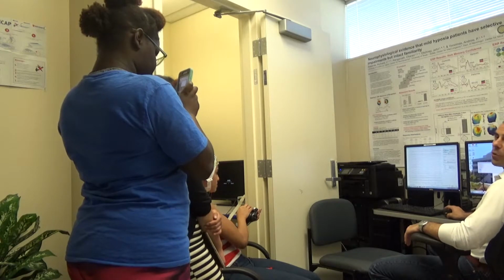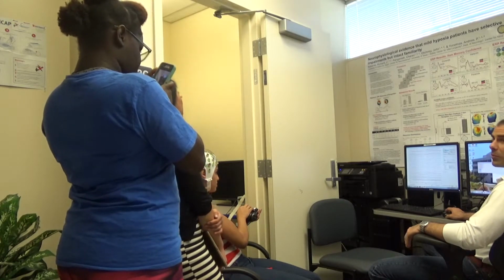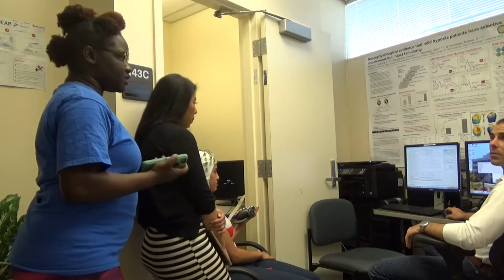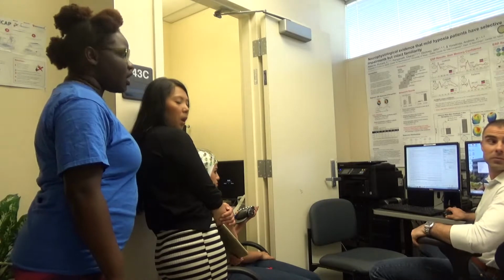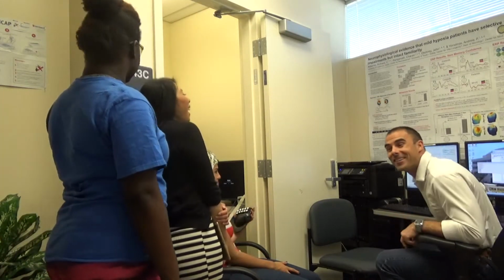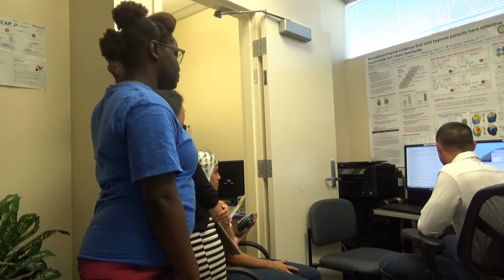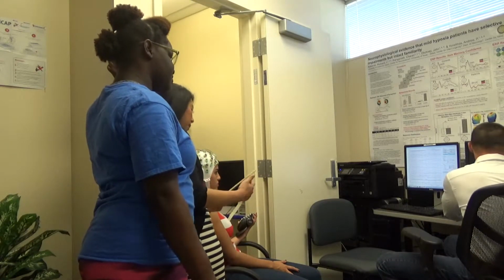So when we clean this up, what are some of the steps that we have to remember that we talked about last class? You guys remember? Oh, like clean up the data, or clean up the actual electrodes? I hope you remember both. I was going to say you have to turn off the electrodes, right? Yeah, so the first thing we would do is stop the experiment here. So you would press stop, and this experiment over here would stop.